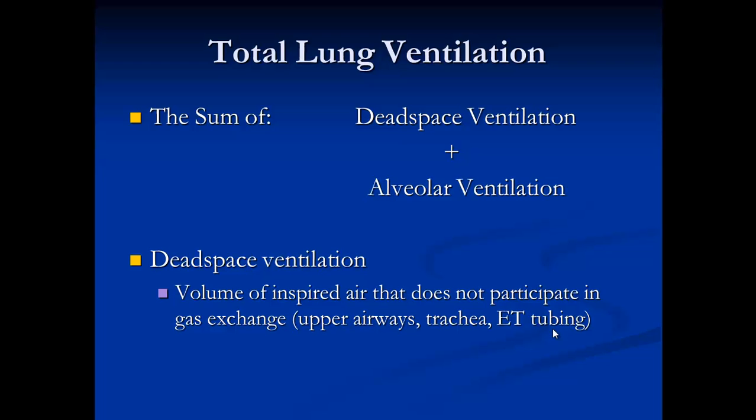What is dead space? It is the volume of inspired air that does not participate in gas exchange. When we talk about dead space ventilation on a patient that is mechanically ventilated, this is not the same dead space as with a VQ mismatch. I'm just talking now about what dead space is when the patient is on mechanical ventilation. It is basically your upper airway.